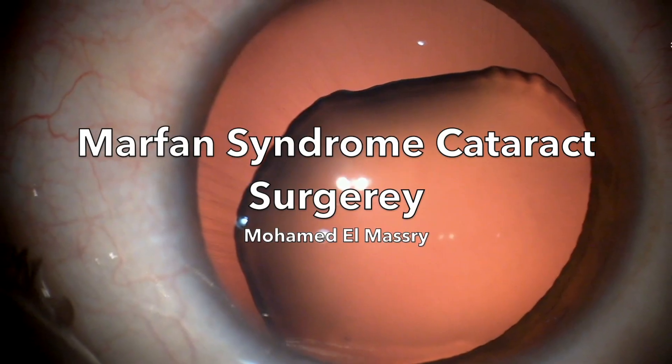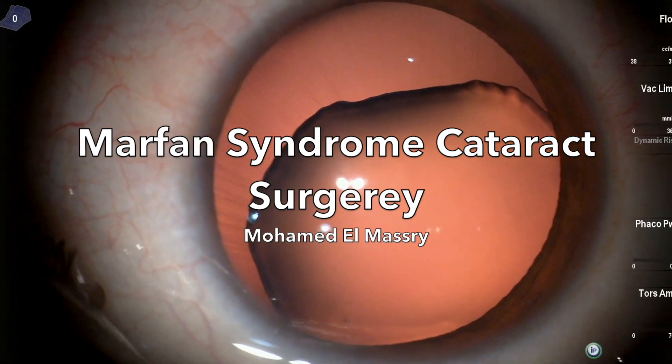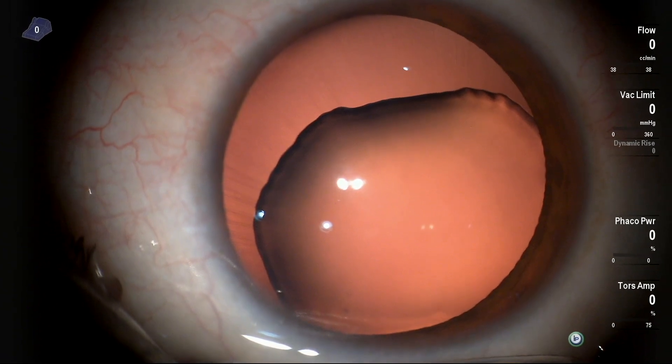What to do in a case of Marfan syndrome when you don't have a CTR segment or a Cionni ring? Let's see this novel technique using CTR and Prolene 10-0 sutures.